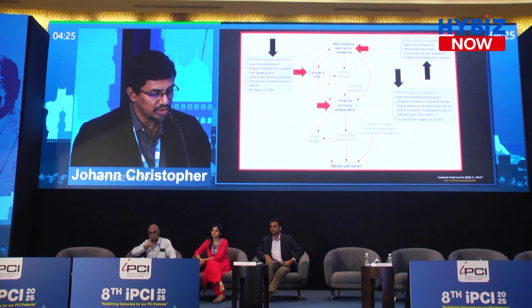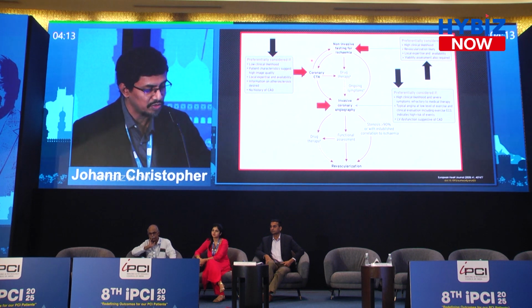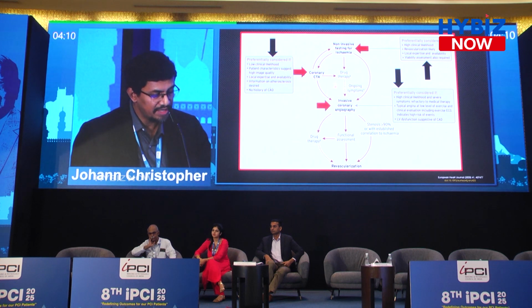And where would you use coronary CT in a line of patients is in a patient who has a low clinical likelihood. You're getting a high image quality on the CT. Local expertise, I think, is one of the very important issues. And these are patients who can be screened very quickly. It takes about 5 seconds for the scan, maybe 20 minutes in total. It's an intravenous injection, so completely non-invasive. And if you find that the patient has normal coronaries, they can be managed medically. A patient with a high-grade stenosis with high-risk plaque features directly goes to the cath lab, and anything in between gets a functional assessment. So it helps us in the routine workflow.